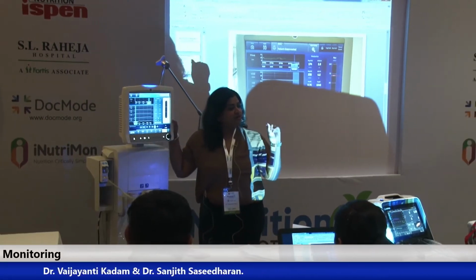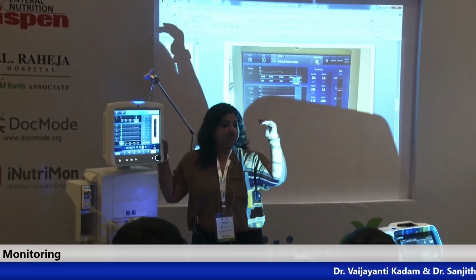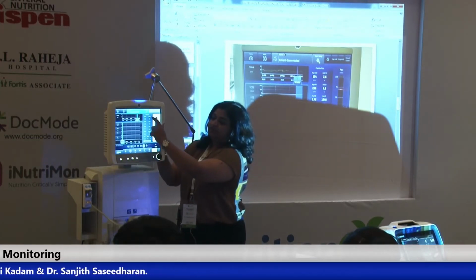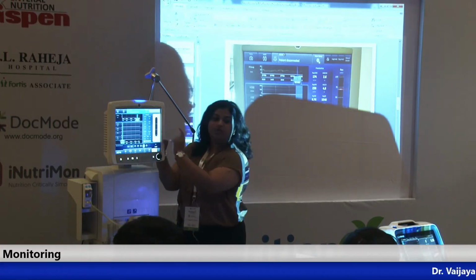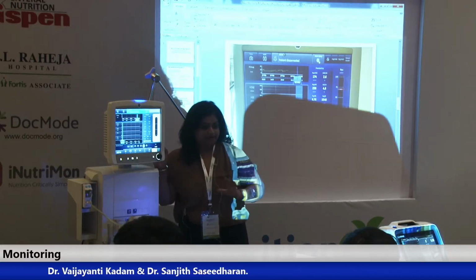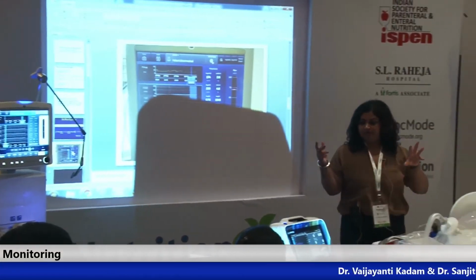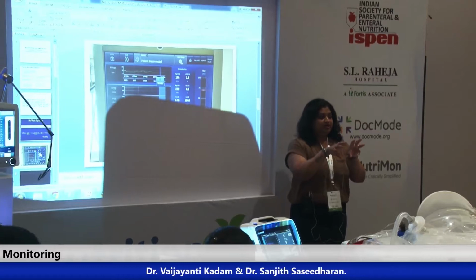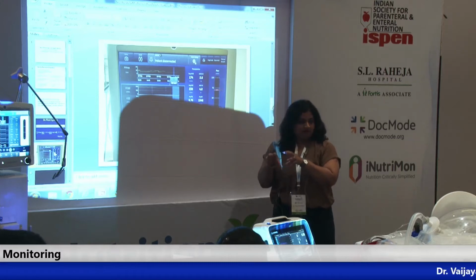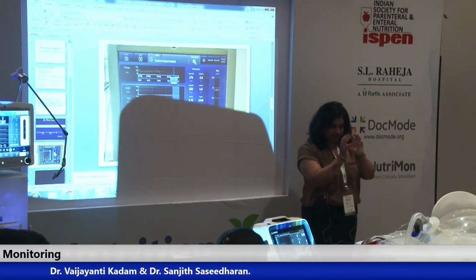What is our normal respiratory quotient? It's 0.8, right? VCO2 by VO2, volume of CO2 by volume of O2, is somewhere around 0.8. That it will show. Then it will show variation of CO2 and variation of O2. What is that for? We need this patient in a steady state. Now there is a cell, and to understand the energy expenditure, what the machine is doing is telling us how much gas exchange has happened and how much heat production has occurred, correct? For that the cell has to be completely steady, it has to be relaxed, it cannot keep working.